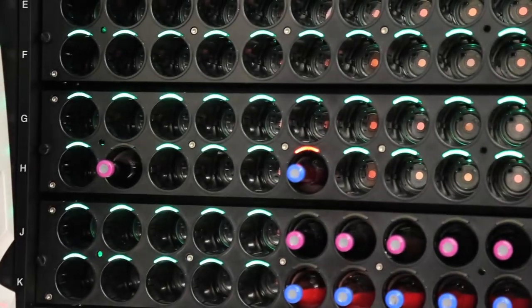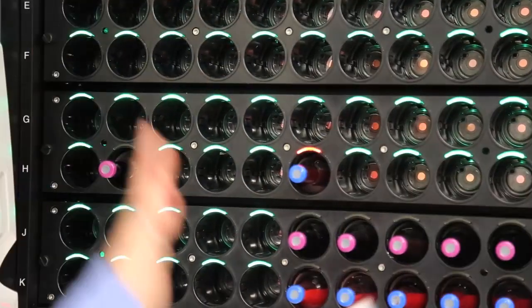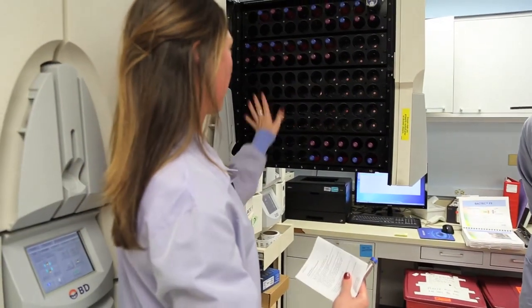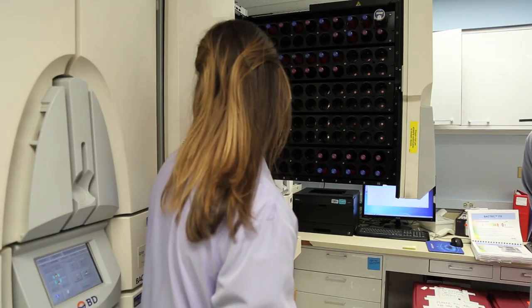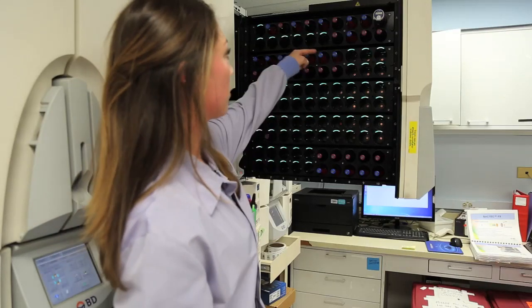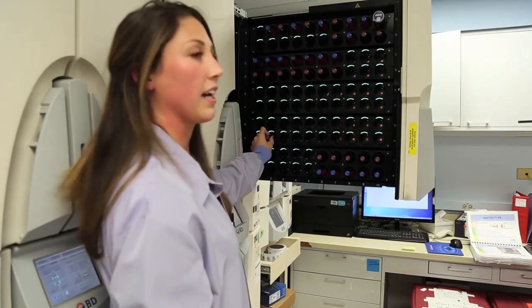So, as soon as we have one that is positive, it flashes red when we open it up so we know which one is alarming, and we will pull it, and then the rest of them go black. So now we know we have the one that it was correlating to. If I go back to the home screen, it will now flash the one that's negative. So all the rest of these are turned off because they're pending, and the green are available. So the flashing green is the negative one.